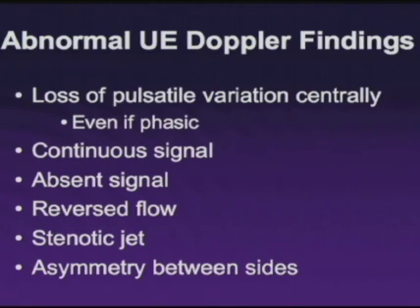Also, because of the higher velocity and the presence of catheters that stenose the veins, we can sometimes see areas of narrowing associated with high velocities, a stenotic jet indicating a stenotic vein. And lastly, of course, we always consider bilaterality and asymmetry as a sign that central obstruction may be present.